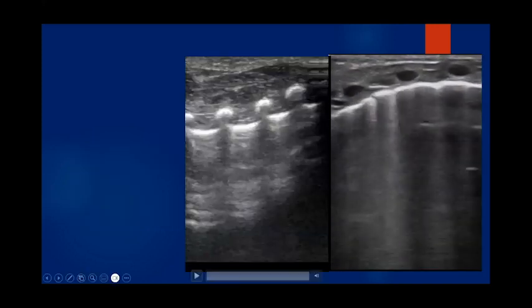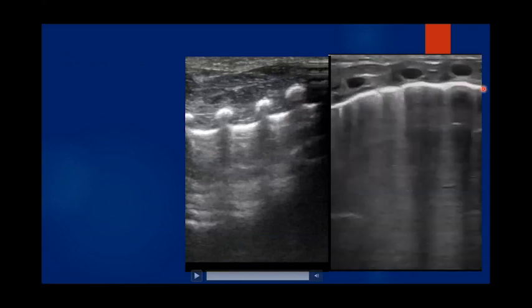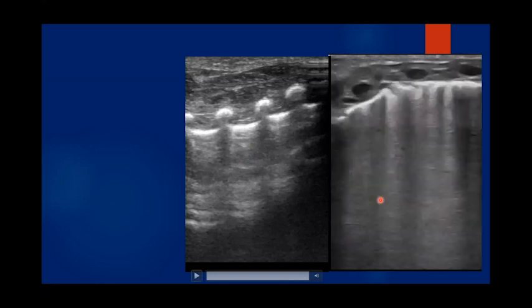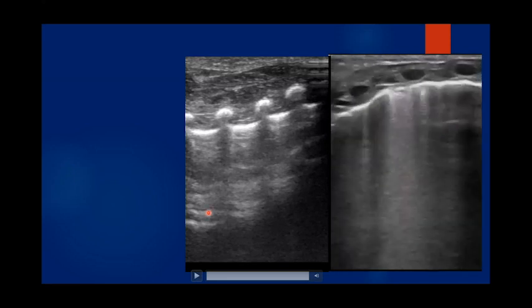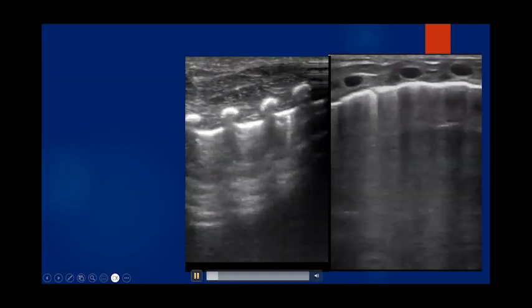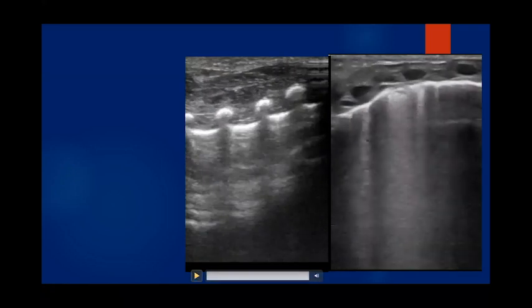So this is what we find in the lung ultrasound here. What we can see is that the pleural line here is thin. It is not shredded. It is not thick. We see some A lines here, and there are some B lines coming from up, down, but they are separated from each other and they are not coalescent. Same thing that we find on the other image here. We see that the other parts of the lungs actually show a predominant A line pattern, well aerated, and so collectively, this is a non-homogeneous scan, a non-homogeneous lung.